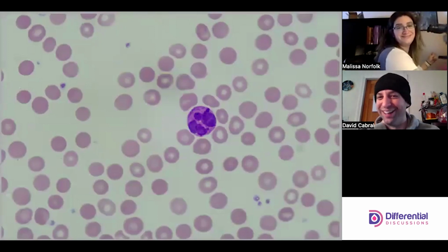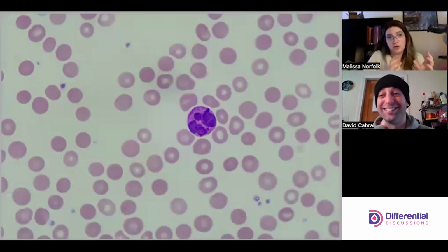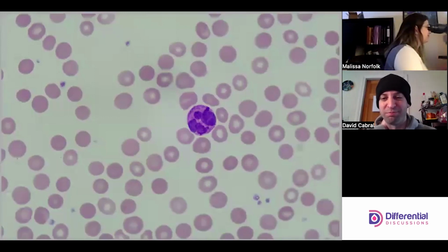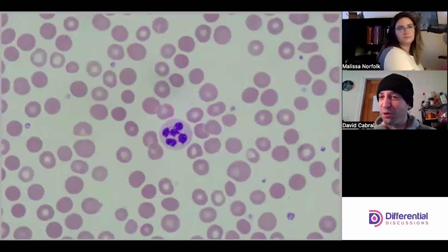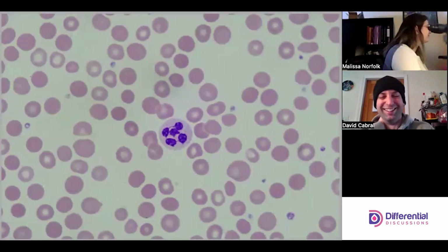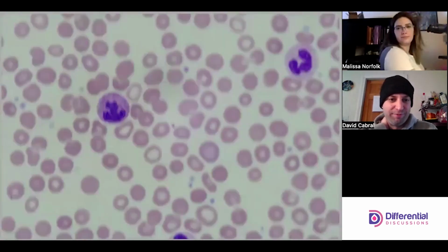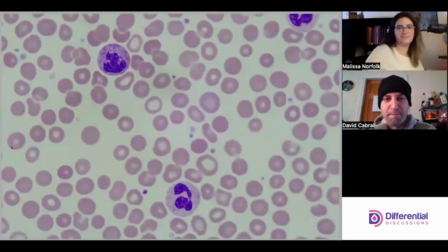Ooh, what up, baso? And so we've seen a couple of basos now, and I just want to point out that it's G-CSF, not neutrophil colony stimulating factor. So there can be other granulocytes as well. Yep, excellent point. This is a really nice example of the filaments that connect the nuclei, the separate lobes. Awesome looking cell. Right on that border of normal for segments, just saying. Let's pull that last neutrophil in. Yeah, nice toxic gran here. Normal-ish looking neutrophil. He may have a couple of toxic granules in there. Yeah, less than his buddy.